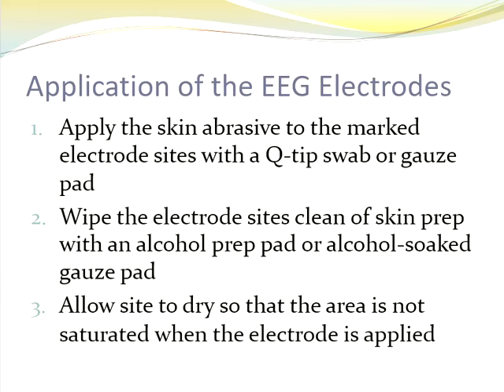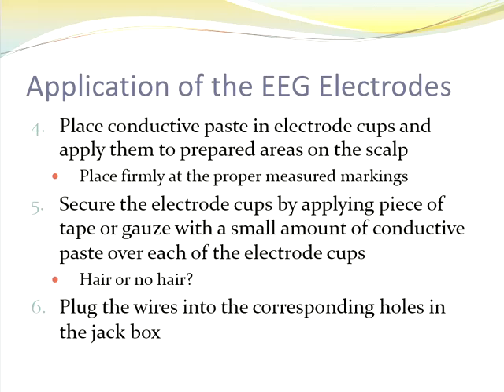You're going to use cup electrodes for all of the scalp leads. And so you're going to take a good healthy scoop of the conductive paste, whether you're using Elefix or Ten20, up to you. And you are going to apply it to the spot that you just cleaned, the spot that you just prepped. Push it firmly down so the electrode paste comes out that center hole, so you know you don't have any air or anything in between the electrode itself.